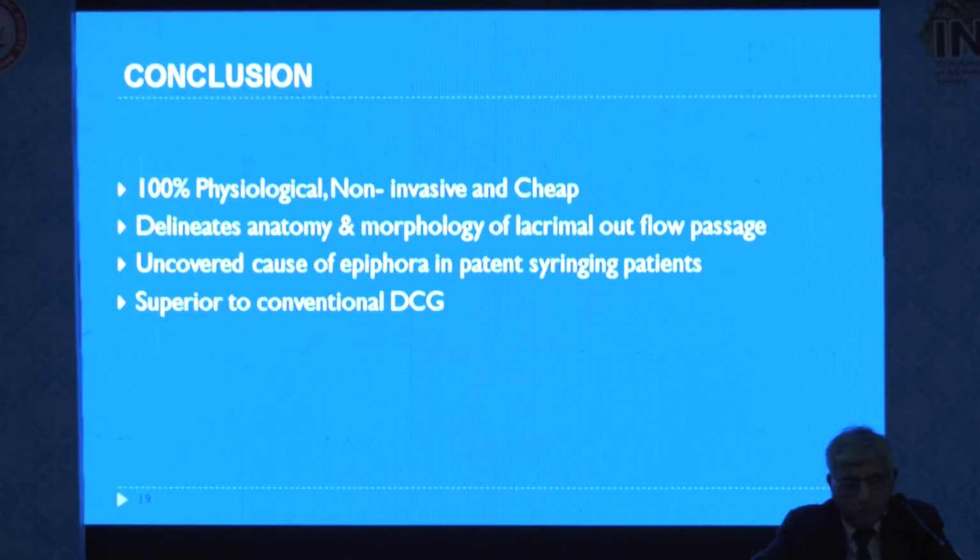Hence, I can say it is a 100% physiological, new technique, non-invasive, cheap, gives very good anatomical details, and it is very helpful in cases of persistent epiphora with patent syringing.